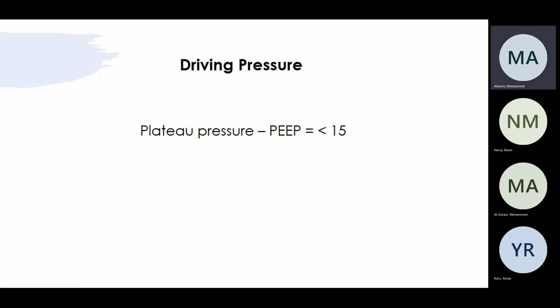All right, driving pressure. Who will tell me why we even talk about driving pressure? Yeah. Okay. The study showed what? Less than 15 and mortality. Okay, so they did a prospective trial and they looked at patients and adjusted the driving pressure, and they found less than 15 improved mortality. I think so. You think so? I think it's retrospective. Yeah.